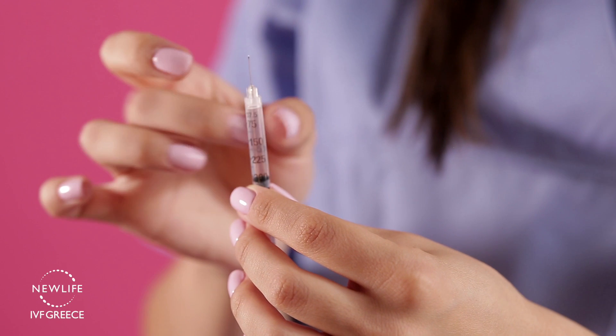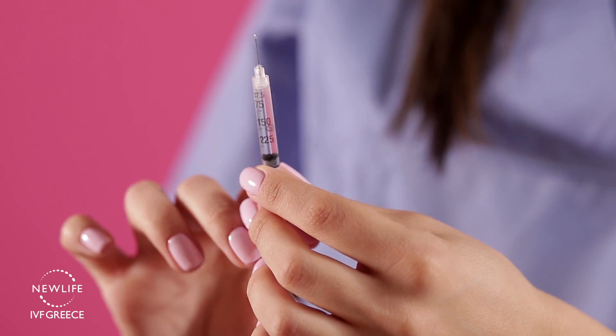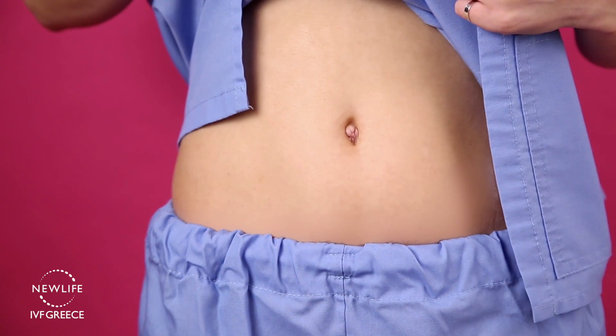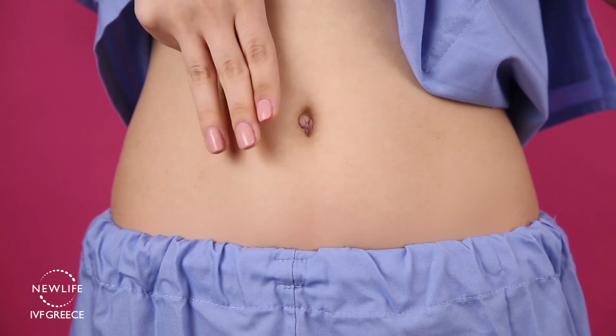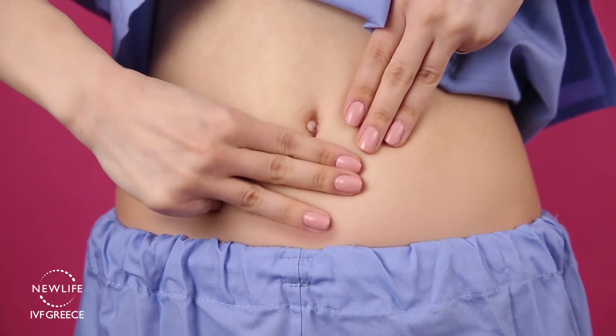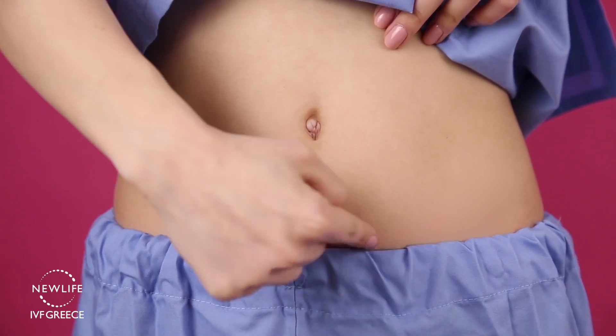This small needle is designed to deposit the medication subcutaneously. Thus, you will need to insert the whole needle into the skin. Subcutaneous injections are performed in the lower abdomen. Use 3 fingers placed under or around your belly button to find the location of the injection. Please note that it is very important to rotate the injection sites.